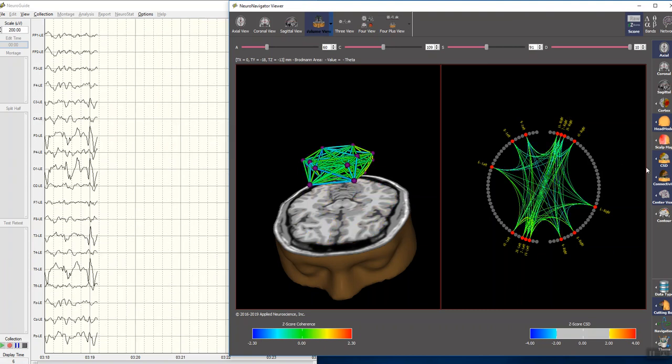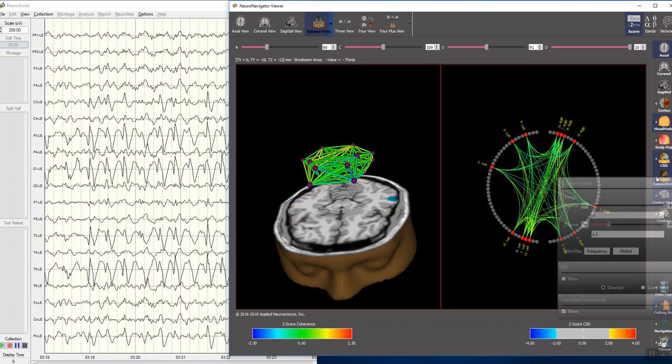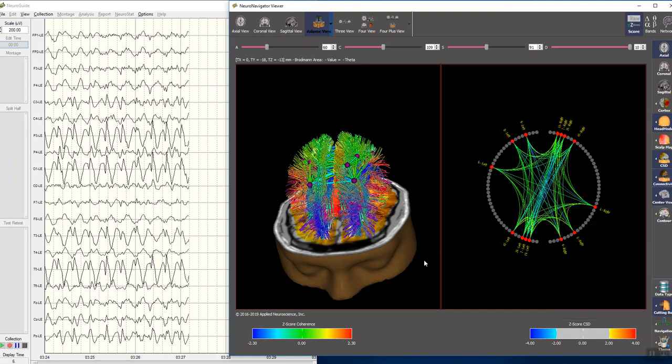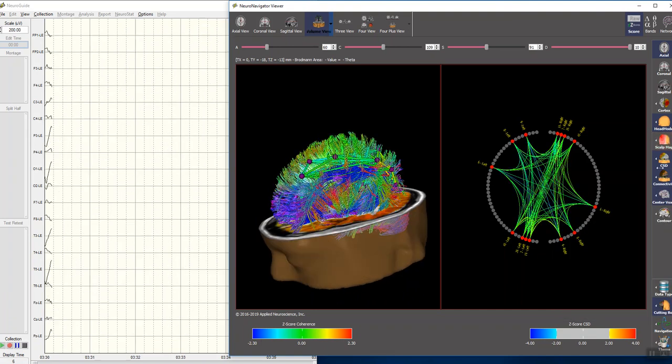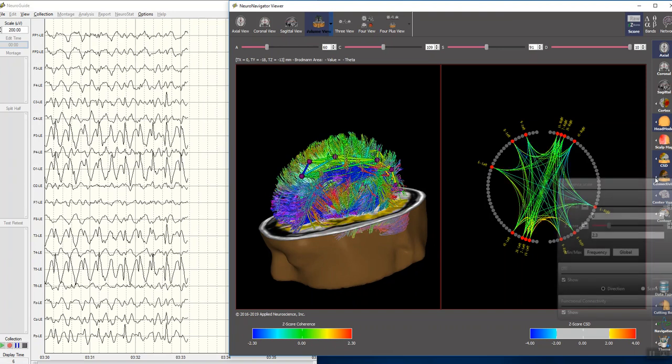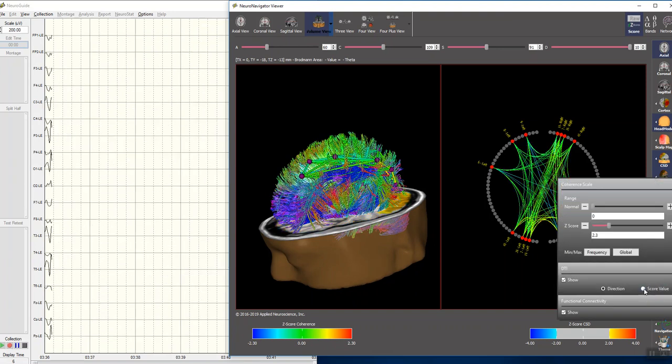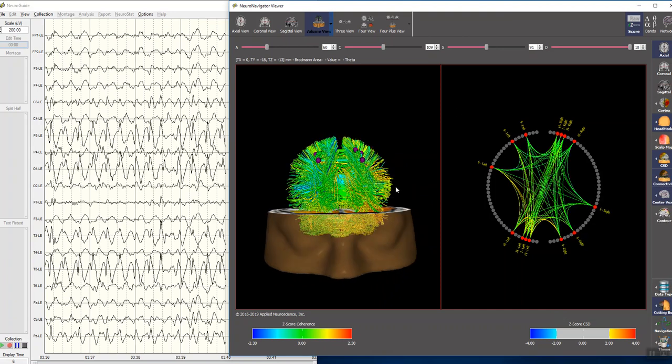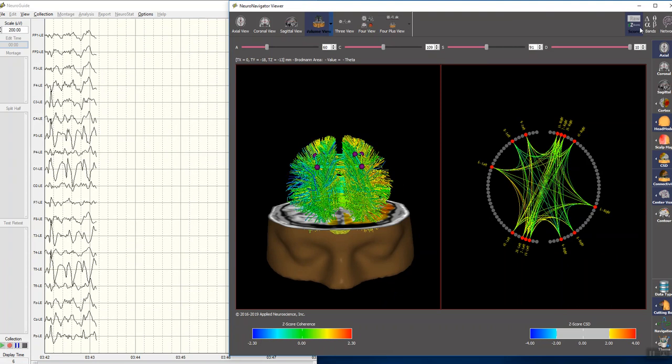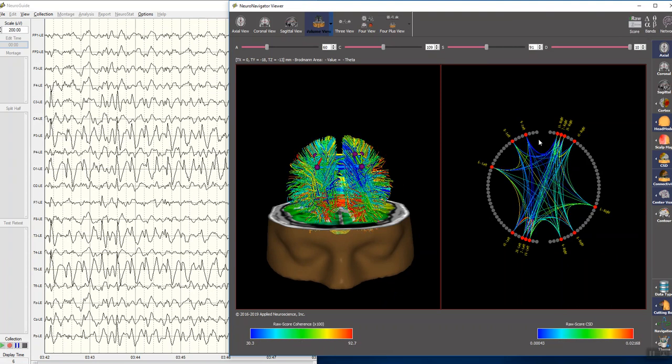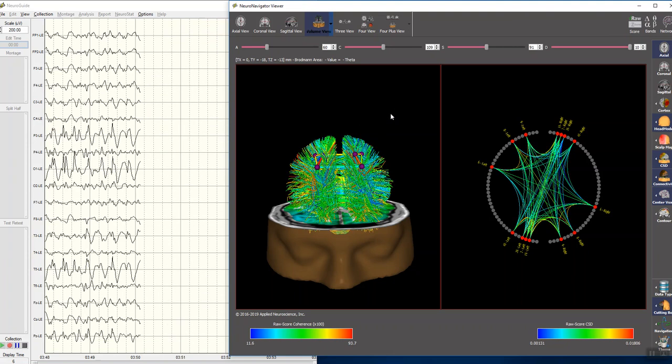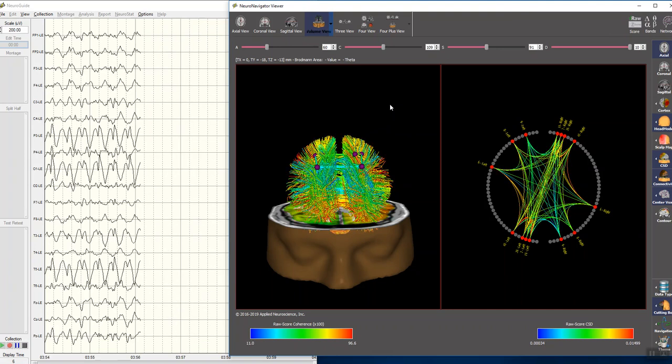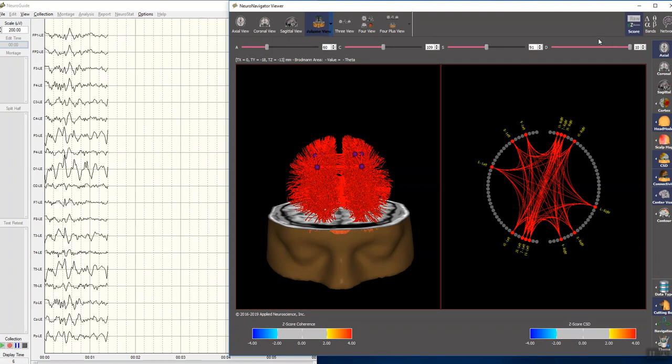And then, of course, also look at the diffusion tensor imaging simply by selecting it. This is the entire diffusion network based on the colors determine the direction of the connections. We can also do z-scores of the diffusion tensor imaging network and we can again select raw scores. So we can look at z and raw and we can launch two neural guides if you want and look at z and raw at the same time. Not have to worry about clicking back and forth, but you can see how quickly you can go from raw to z and z to raw.